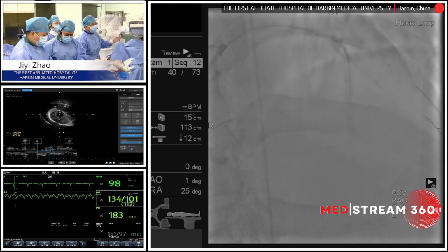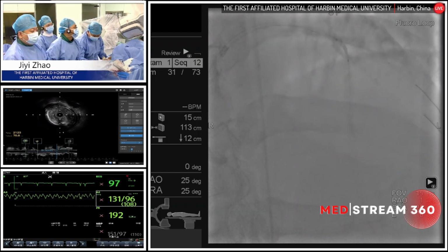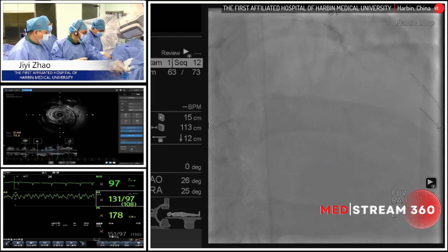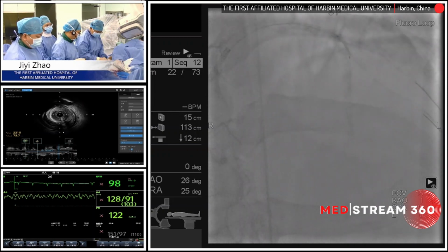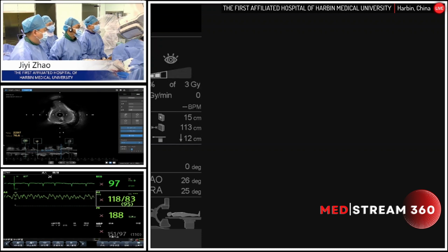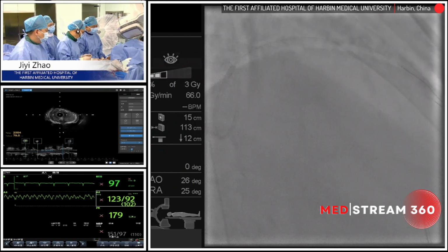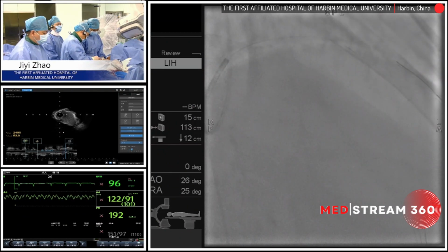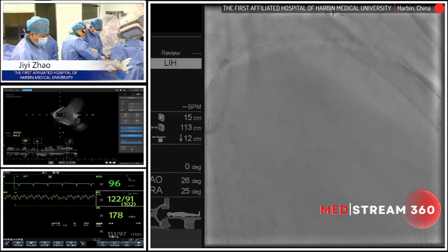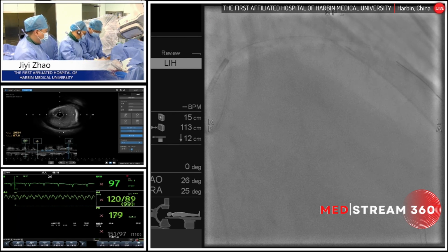This is a long diffuse lesion with a relatively large plaque burden. And from the IVUS image, I think that gives us very important information. One thing is that we can see a lot of attenuated plaque, and the lesion length is relatively long. This patient has, at the mid-distal part of the LAD, a focal severe stenosis with a relatively small vessel caliber.